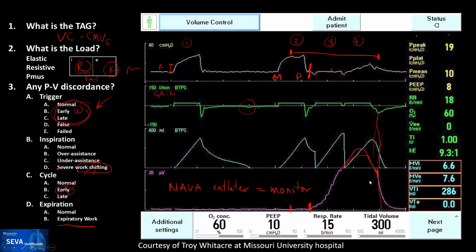Thoughts? Comments? Troy, you want to make any comments here? No, not really. I appreciate what you folks are talking about. I just know what I saw visually. It didn't look like there was any patient effort when I did an expiratory hold. We were looking for nasal flaring or any kind of abdominal movement.